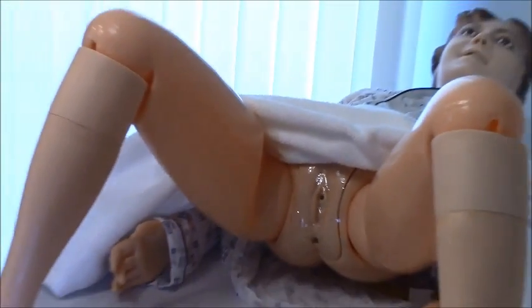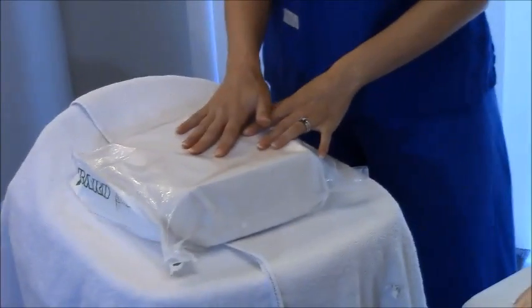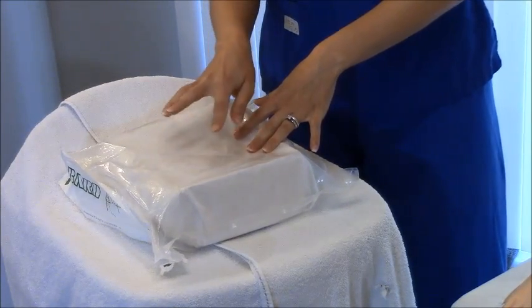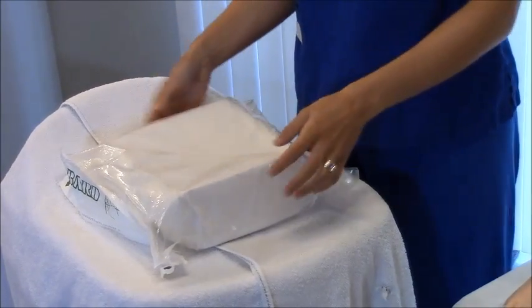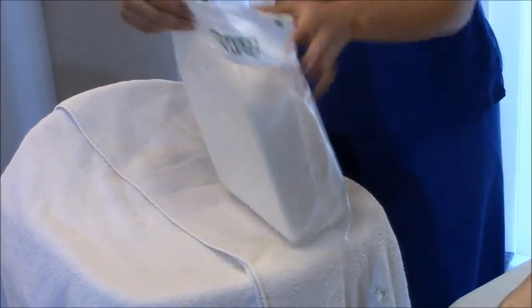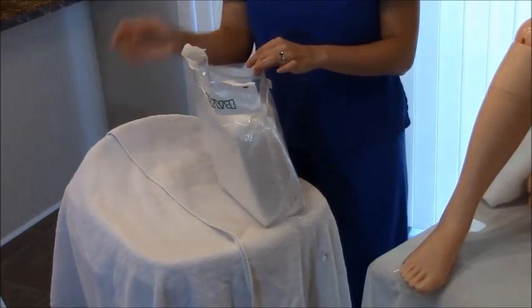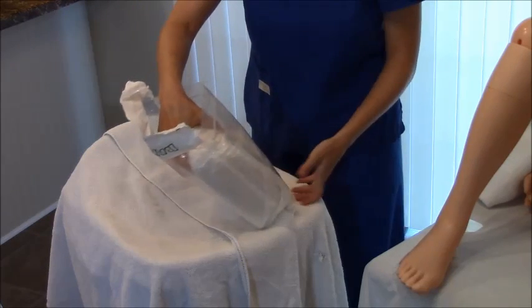Go to your kit — it comes in a plastic bag. Be sure you grab the correct kit, as some kits in the clean hold are just the Foley bag and others are just the prep supplies. You want a kit that has both the Foley bag and the prep supplies. I like to use the plastic bag as my trash bag since I'll have cotton balls and other items to throw away — it's easier than reaching for a trash can.